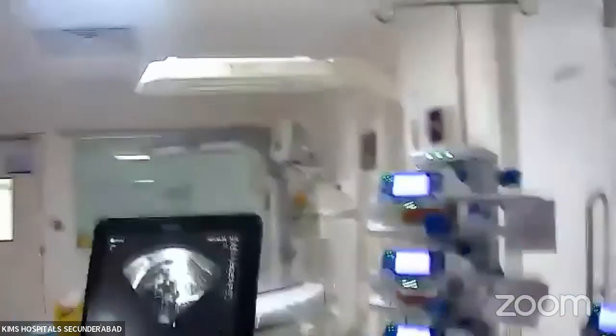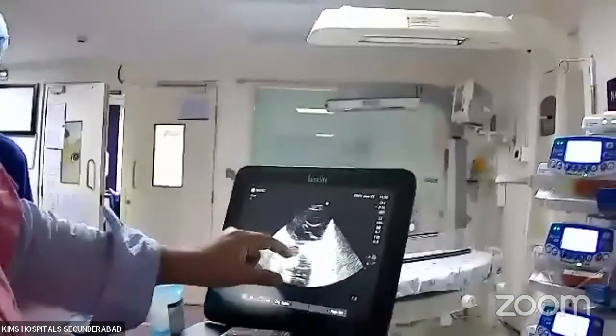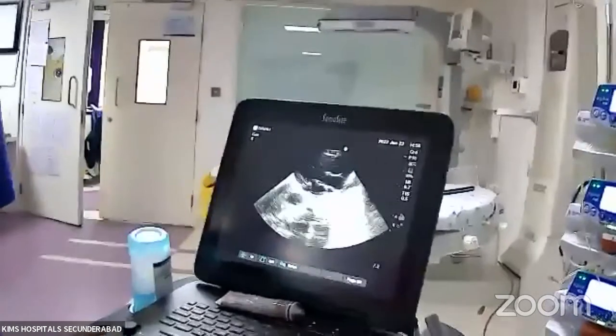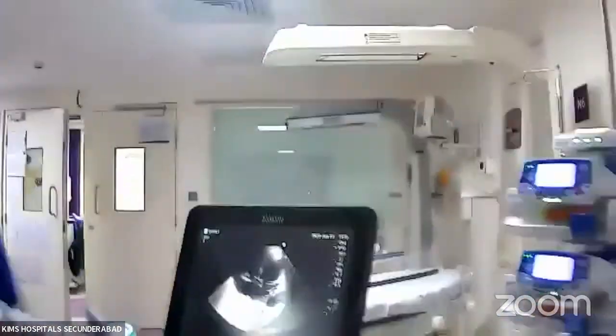Aorta, if you see even in long axis here, you will not see any branching. See, this is aorta long. There is no branching of the aorta except for the coronaries, if you are able to see. So that means it's a late division. So now these are the things. Second thing, now we come to the pressure thing.